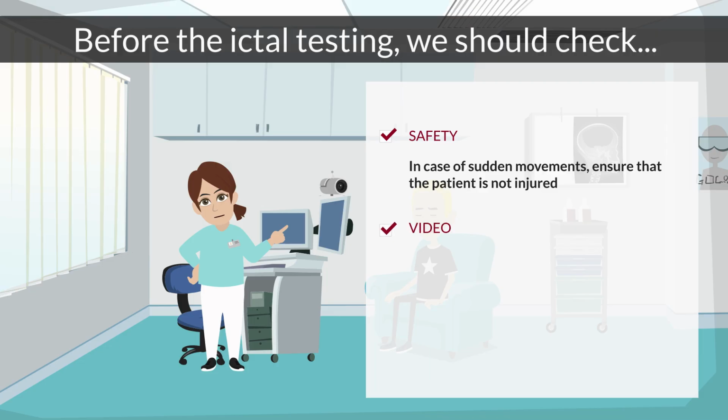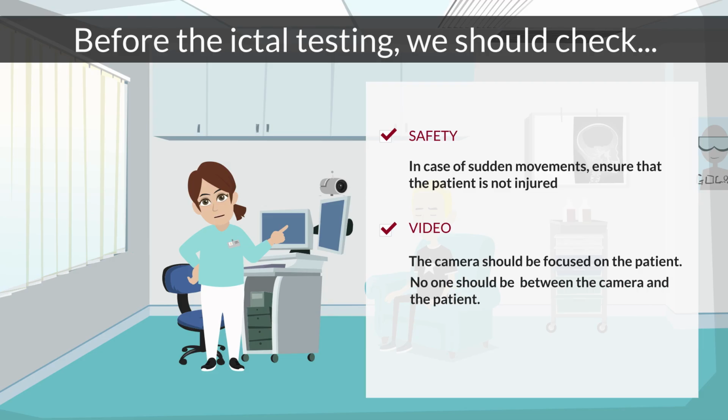Video. The camera should be focused on the patient. No one should be between the camera and the patient. There is enough light. The patient is not covered by sheets. Beginning of the test.